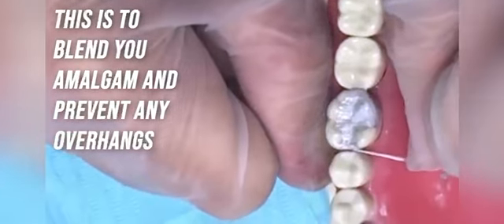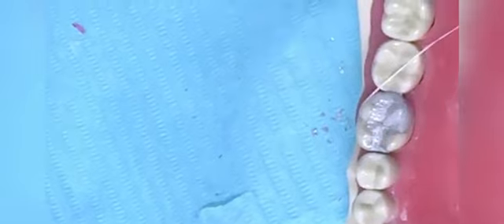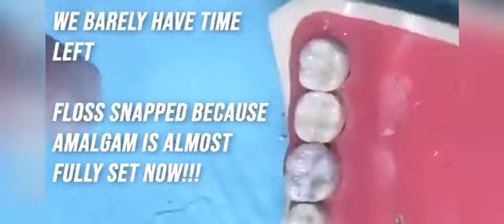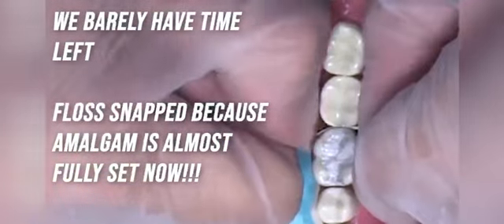Here we are checking the contact. Contact should not be too tight or too light. If there is no contact, it is a direct fail. If it's too tight, it means there is a cervical overhang, you have not done the separation enough, and you have not done the burnishing of the band enough. So try to select the proper wedge. Number 3 wedge is, I think, enough every time. They give a wide contact mostly. And try to burnish your band very well.